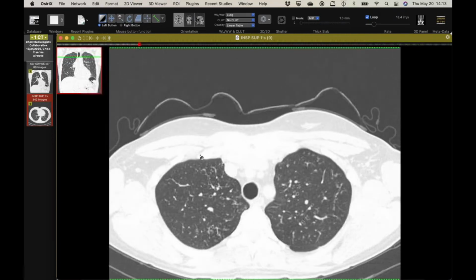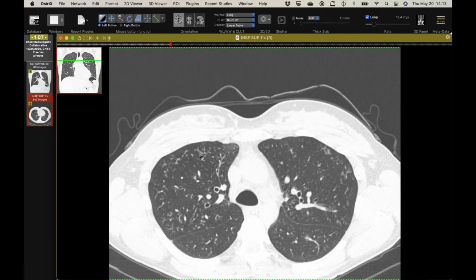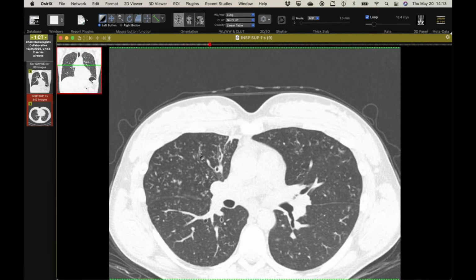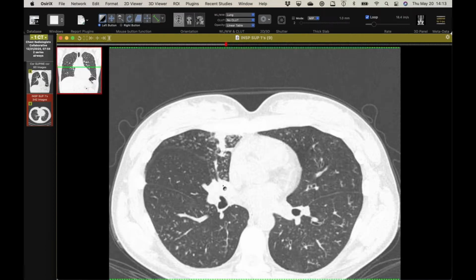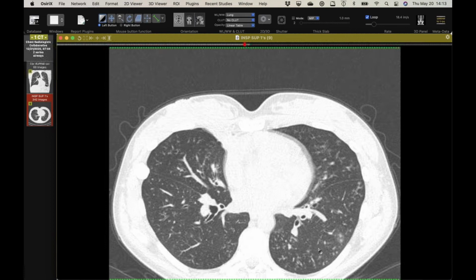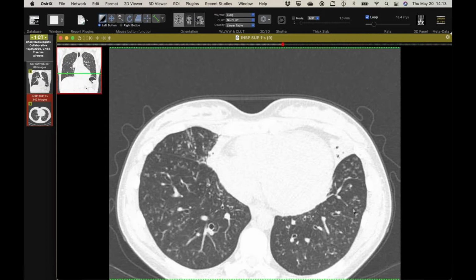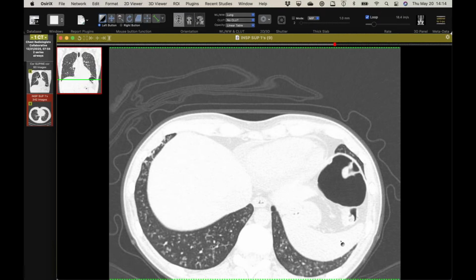So here's another case of airways disease, and you can see there's lots of tree and bud. Her larger airways aren't quite as sick as the last guy's. There may be a few areas of thickening. I think there's some minimal bronchiectasis in a few areas like that. The bronchus is too thick there, but it's much more extensive small airway nodules. And then she's got a few ground glass nodules around some of this, so probably just more extensive inflammation, tree and leaf or something, if you want to call it that. And then pretty extensive down here in the lower lobes.